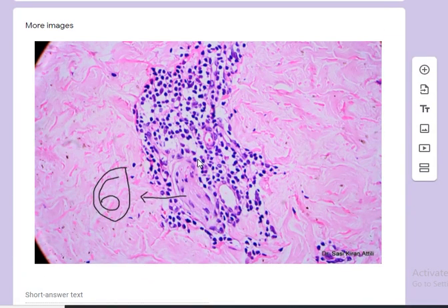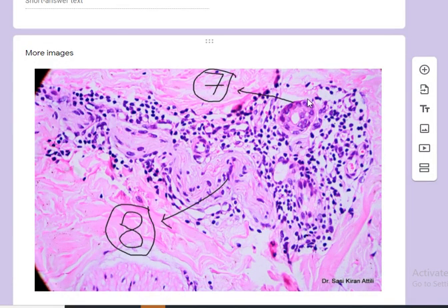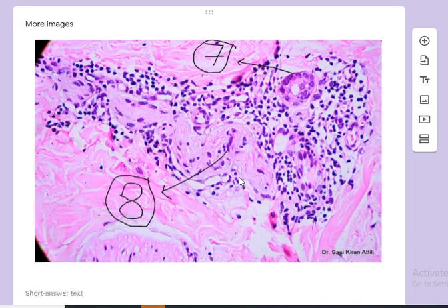Going to the next image, what is prominent in this particular case is this very distinct perineural infiltrate. So this is a nerve. So number 6 is a nerve. This is a nerve fiber, and these are nerve cells, slightly more spindly and wavy. And this is quite prominent here. Number 7 is an eccrine gland again. And you can see the nice curvy nerve fiber here with some neural cell. Number 8 is essentially pointing out a neural cell.